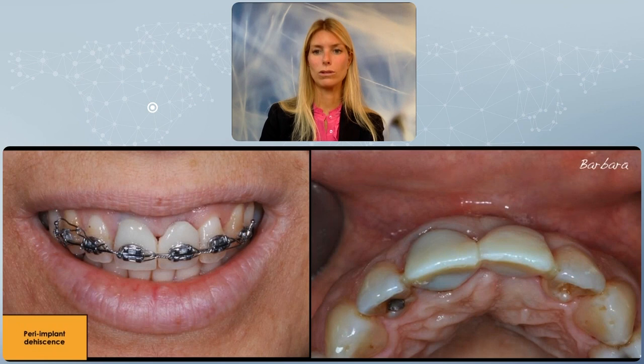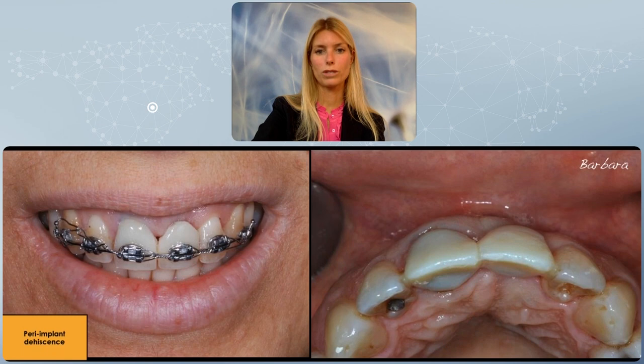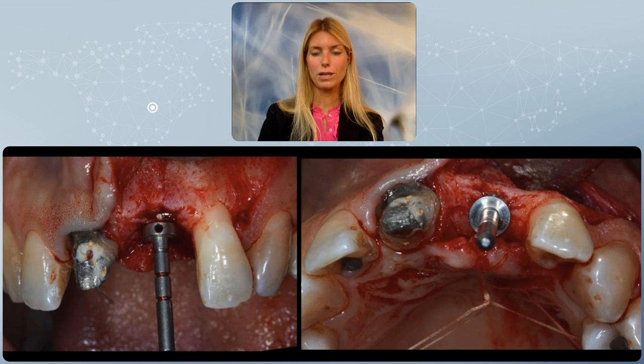So this is certainly not a tremendous case. However, again, look at the smile line. Look at the smile line of this patient, which is extremely high. She is a patient who has lost the upper left central incisor, and we can immediately foresee that we will have a bone deficiency and a soft tissue deficiency as well. When the implant is positioned in the right 3D position, we can see already a crack in the buccal alveolar bone, and we can see that there is a slight dehiscence.